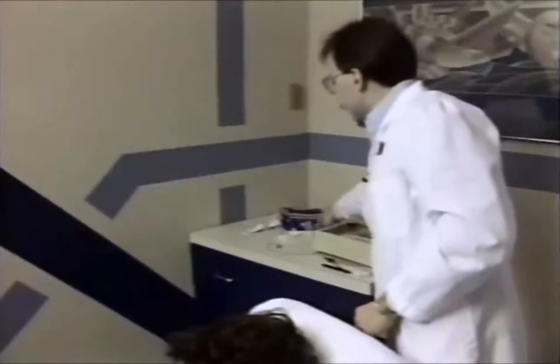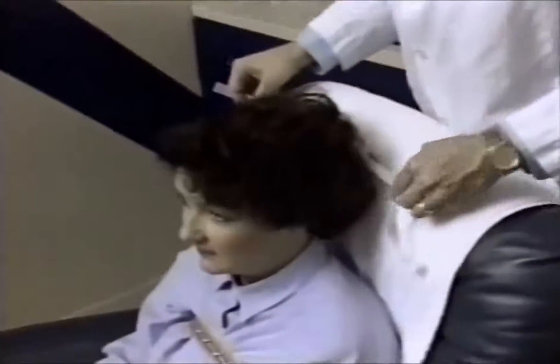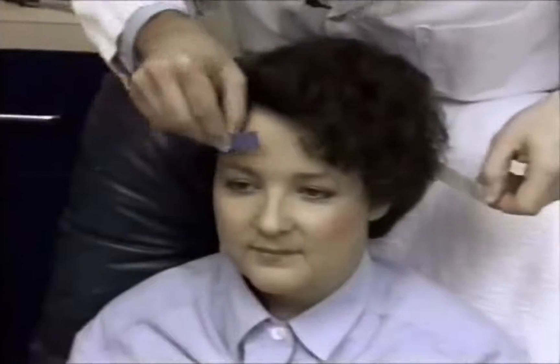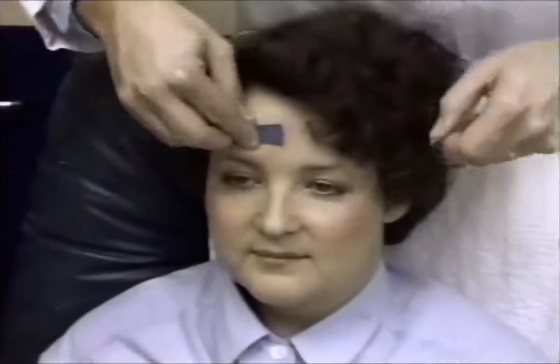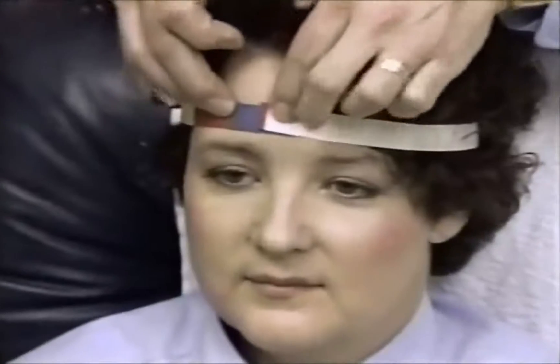The circumference of the head is measured with a special color-coded measuring tape or an ordinary metric tape measure. The tape measure is wrapped around the patient's head approximately one inch above the nasion and one inch above the inion — the prominent bump on the back of the skull.